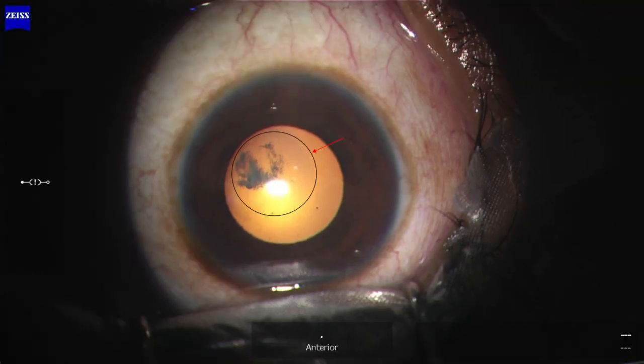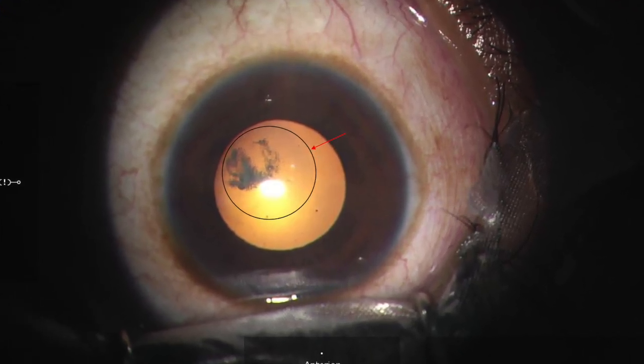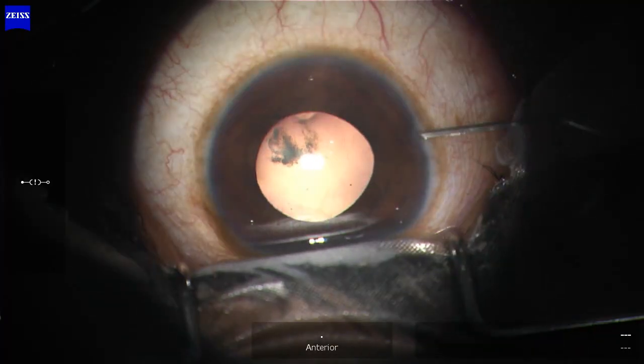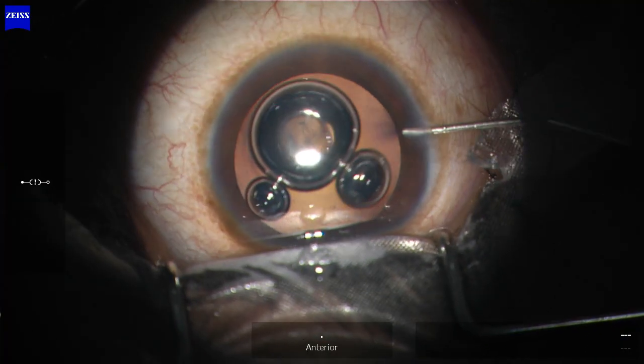Intraoperatively, as we can see, an eccentric cone can be visualized. Standard phacoemulsification was carried out with very careful capsulorhexis, as the capsules are very thin and fragile and have a tendency to run away.